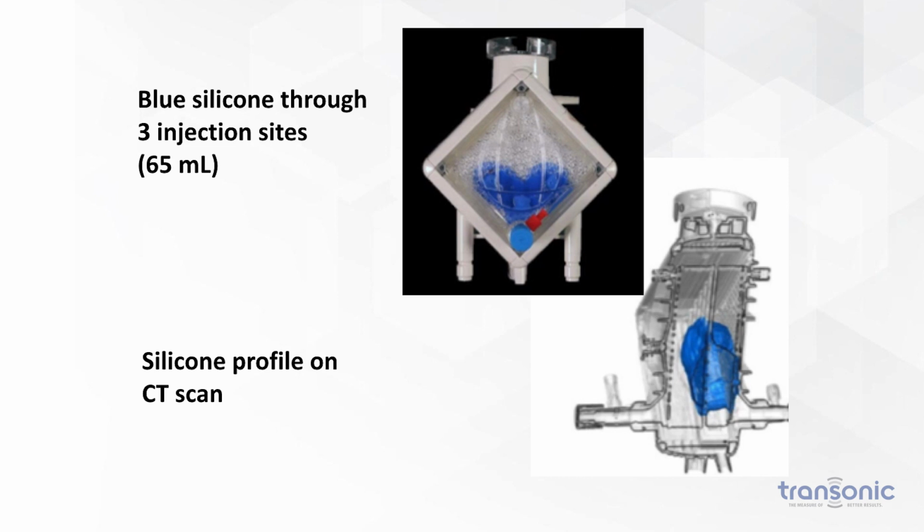You can see the small amount in the face that would barely be visible if it was blood, matching the color of blood. And there's a lot of wide open fiber, so you wouldn't see any difference in the pressure differential. However, in the middle, 65 cc's is 1/3 of a 215 cc oxygenator, and you can see a lot of clot inside on CT in the lower diagram.